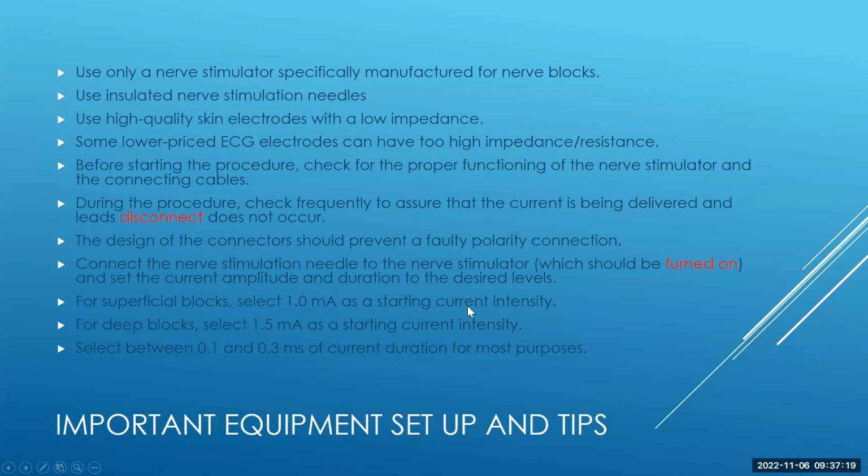I've been doing this for 22 years, and I can tell you, I've seen some amazing stuff. People say, I can't get this nerve, I can't find it. Especially during the stimulation technique days, the stimulator was on pause, or it wasn't even on. And it's like, okay, let's start with step one. Let's turn the thing on and make sure we can stimulate appropriately.